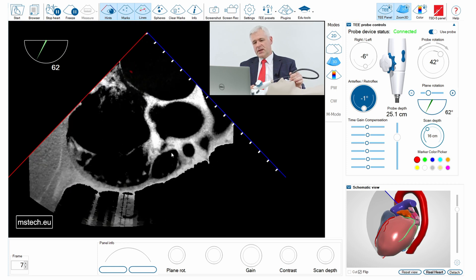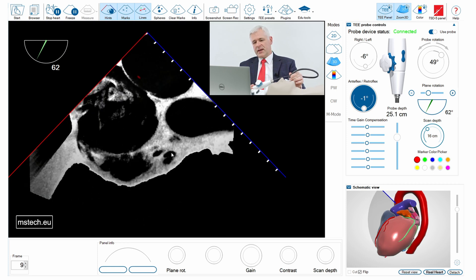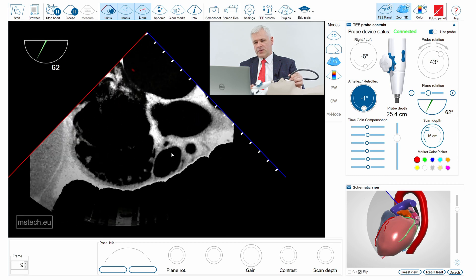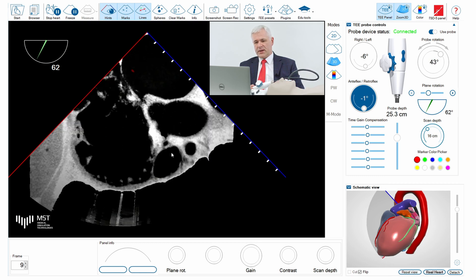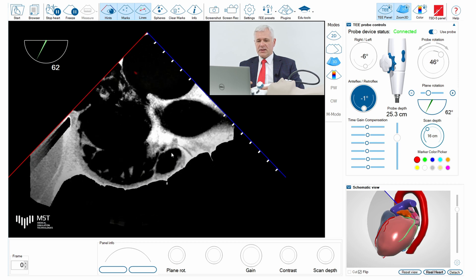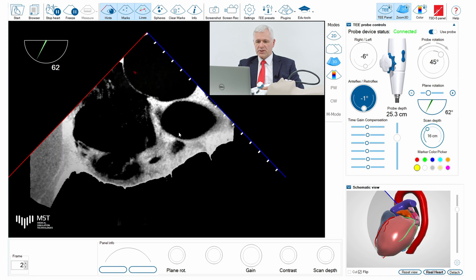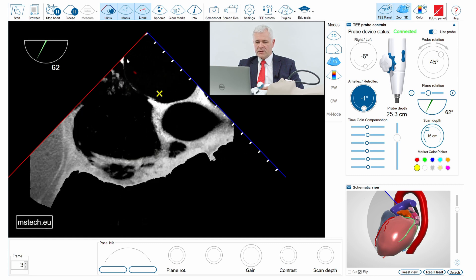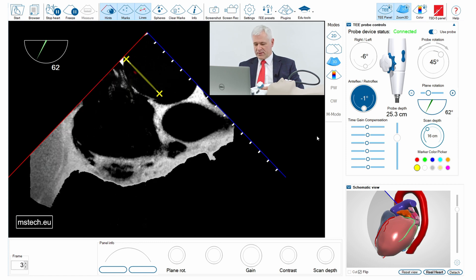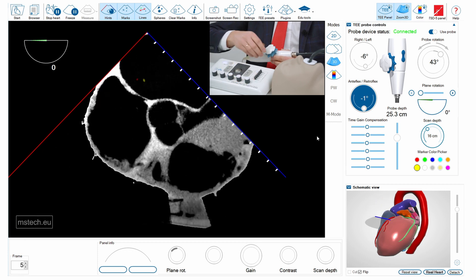At 60 degrees, we can see the short axis view of the septum together with the aortic valve and the posterior wall of the left atrium. Here I can see that if I want to do the puncture, I have to be far from the aorta and not too close to the posterior wall of the left atrium.